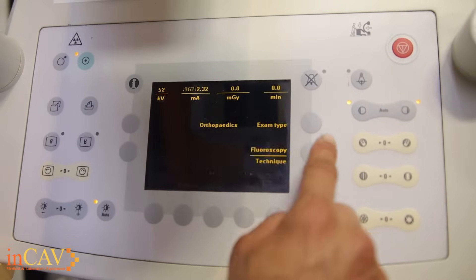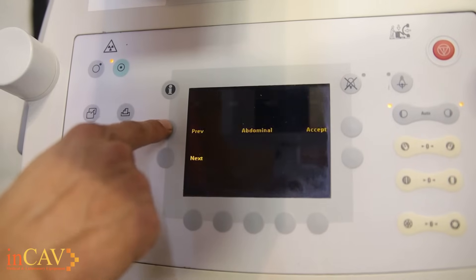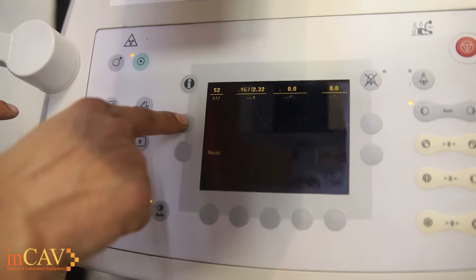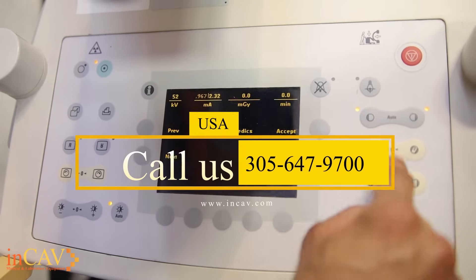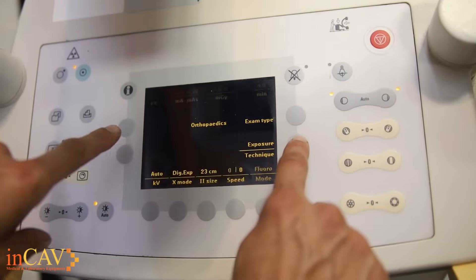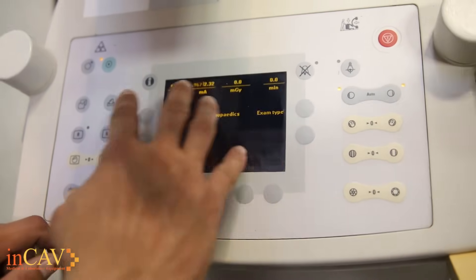From here you can choose your exam type. By selecting the top one, you can actually change the type of exam that you're doing, so that it's labeled correctly on the patient list. You have orthopedics, head and spine, vascular cerebral, vascular HQ, CO2, abdominal, thorax — the whole list of what you need in terms of your patient and the procedure that you're performing. Once you have the one that you want, simply hit the accept button on the top right. You also have here your exposures, fluoroscopy technique, exposure technique, which will list a couple of different things including your MA.